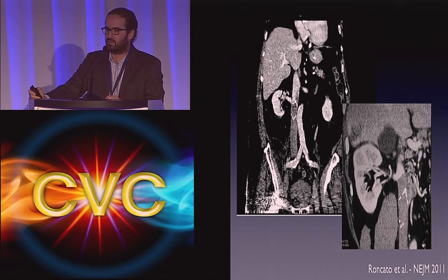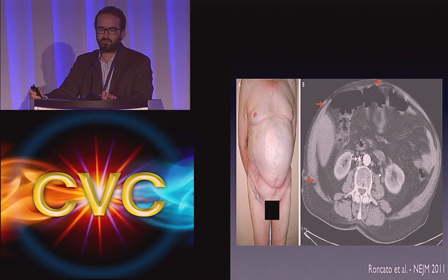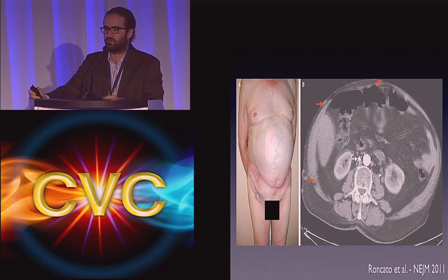This is a typical CT finding that you'll have. Your IVC, normally distal to the filter, is occluded, but it remains patent above due to the inflow of the venous outflow of the renal veins. So that's why, as a technical tip for those who don't do a whole lot of IVC filter placements, you do have to place it there for that reason. If you put the filter above the renal veins, then that is something you might potentially find. And this is one of the classical findings in patients with occluded IVC filters, with all the clear collateral pathways.